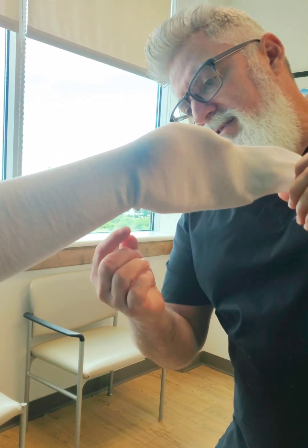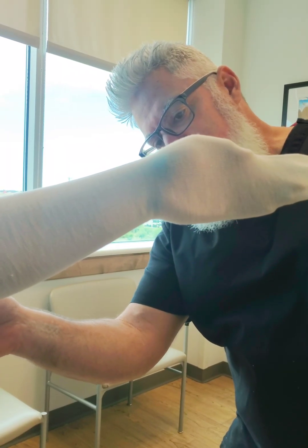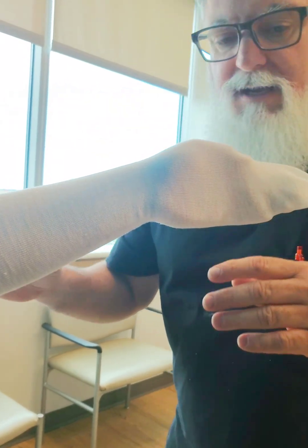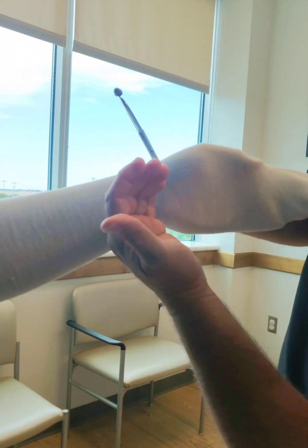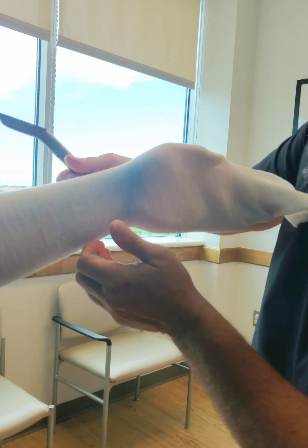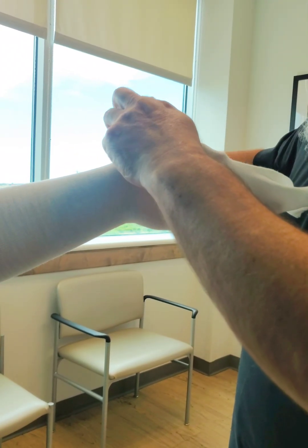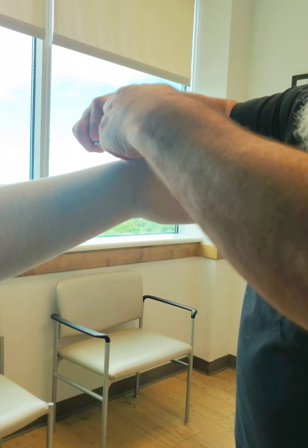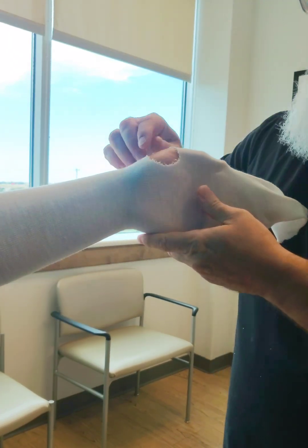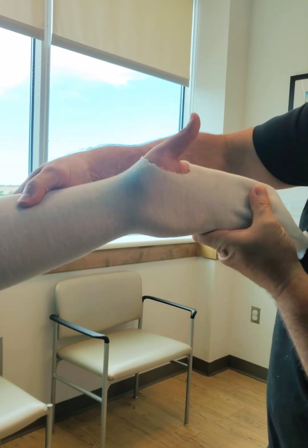And this is exactly why — as you're making the cast, you want to make sure you never have any wrinkles in there. You want to eliminate any kind of creases. You don't want any kind of creases or wrinkles, as little to none as possible. You don't want to have any kind of skin breakdown. If you have to go back to it, just like so.